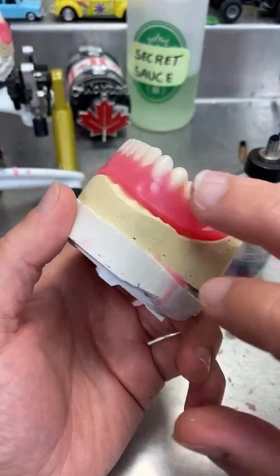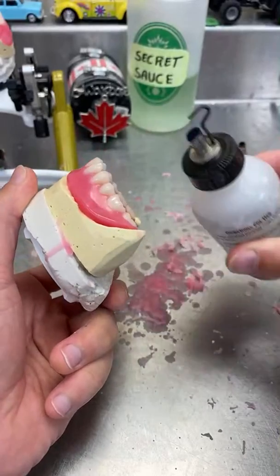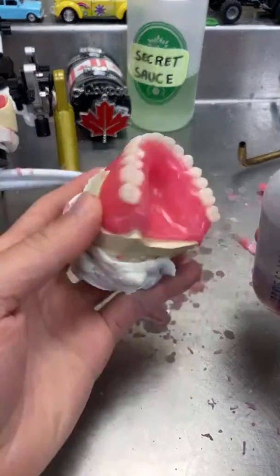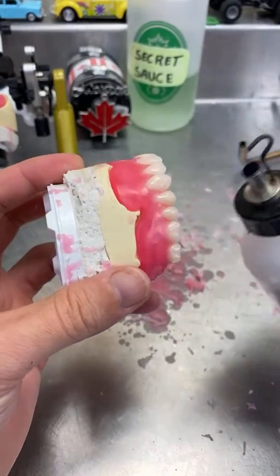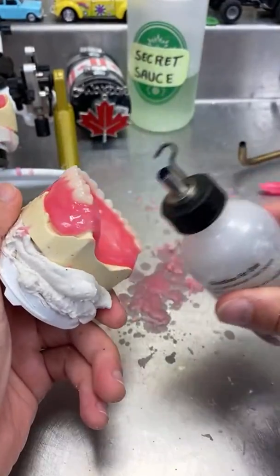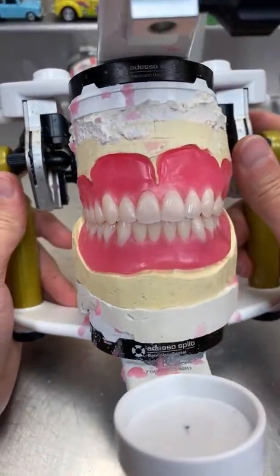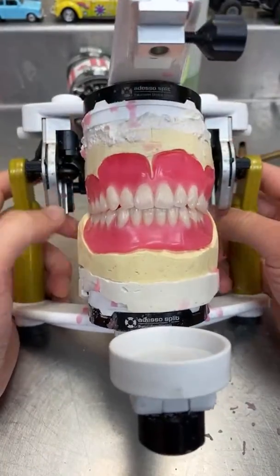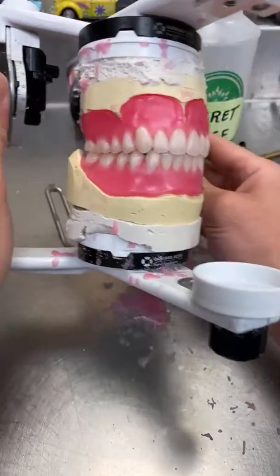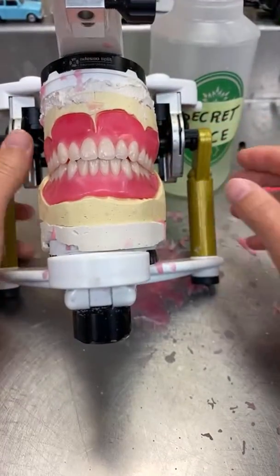So I'll try to just lightly flame all the places that I carved right now. Okay, that's good. Now it's all good here. One thing left, which is just shining the wax here, but I showed you it doesn't really need a lot of work, because when you keep it nice and clean, you don't really need to do the shine, but I'll do just one for you.